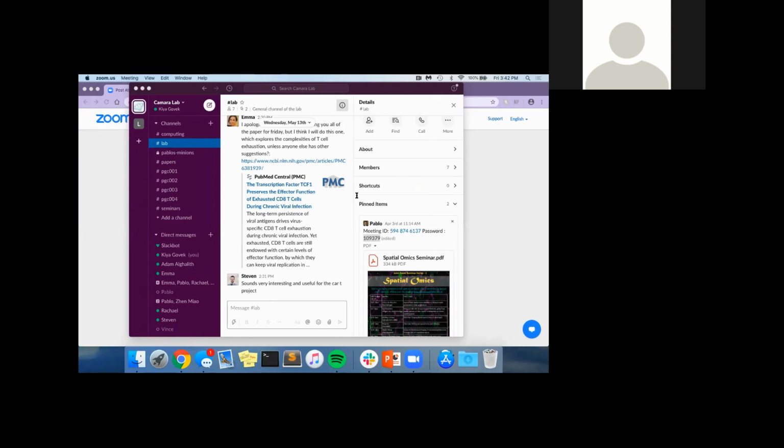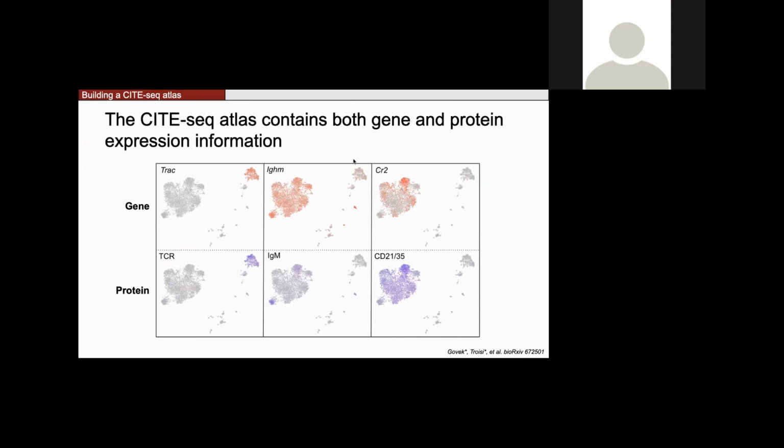Thanks for the great talk. One codex cell may be similar to many CiteSeq cells. Since this is a many-to-many mapping, how do you uniquely assign gene expression value for each codex cell? That is an amazing question, because that's something we spent many days talking about and trying to work on. So right now, the way we do it is each codex cell is mapped to multiple CiteSeq cells.